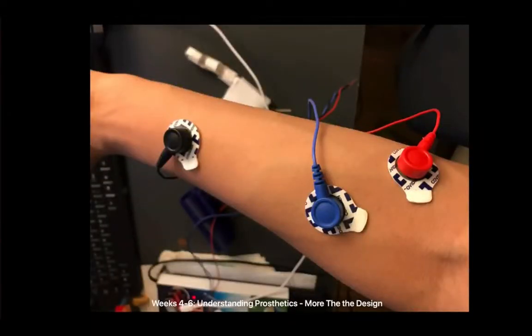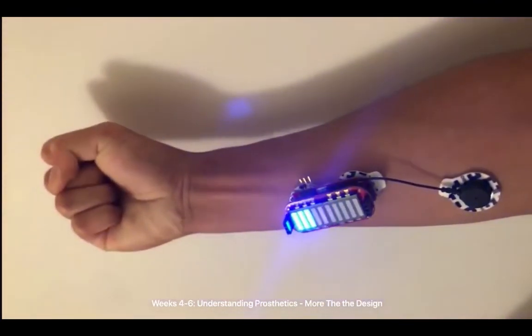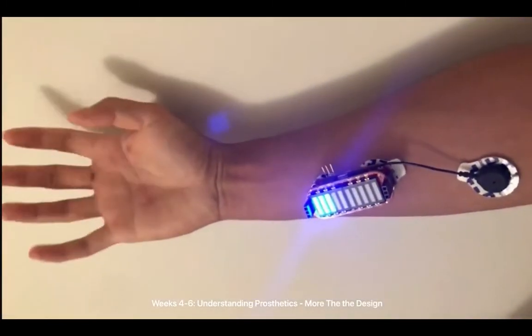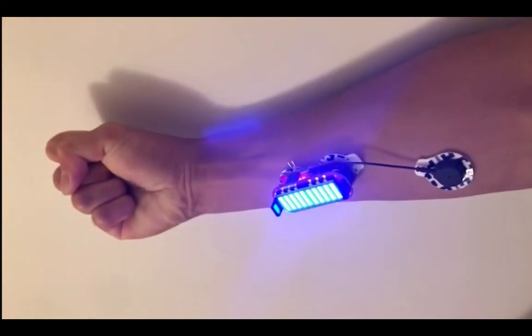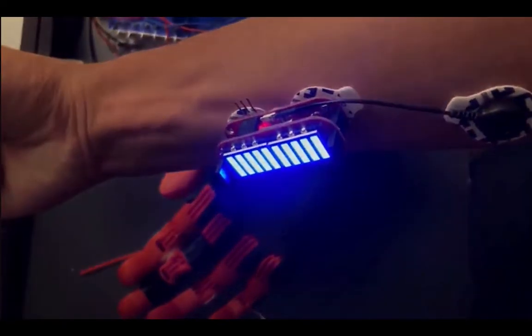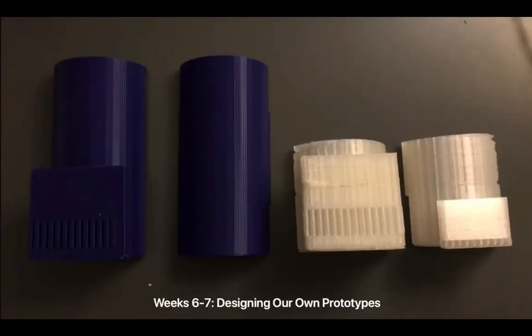Now, the design of the hand is only one part of the problem. The next part of the problem is making sure that the hand could actually move and function with the human body. For this, we had to program Arduinos and attach sensors, which detected the flexing of muscles in the arm. This would signal for the motors in the prosthetic hands to move the fingers. And so we finally moved on to designing our own prototypes to fit on our classmates' hands.